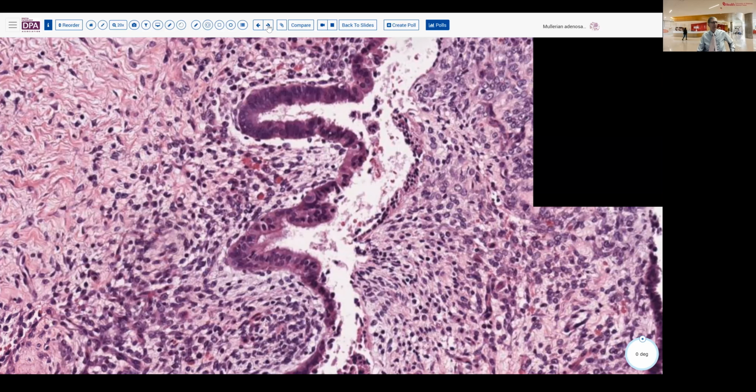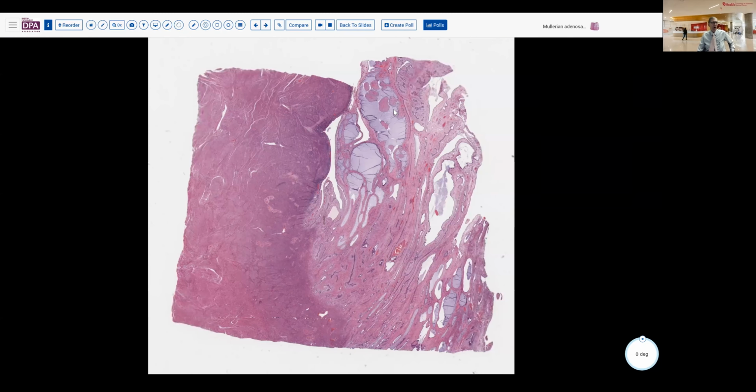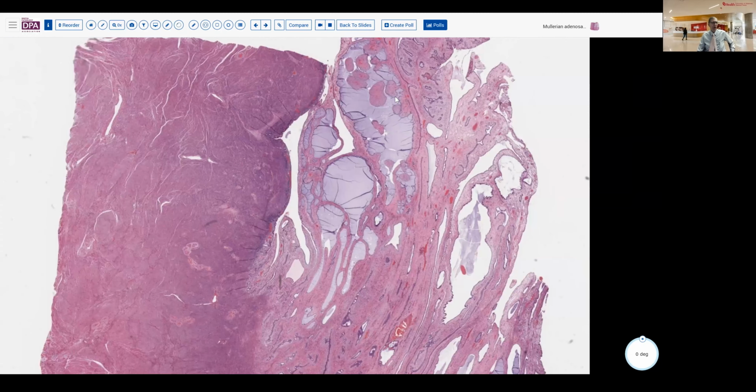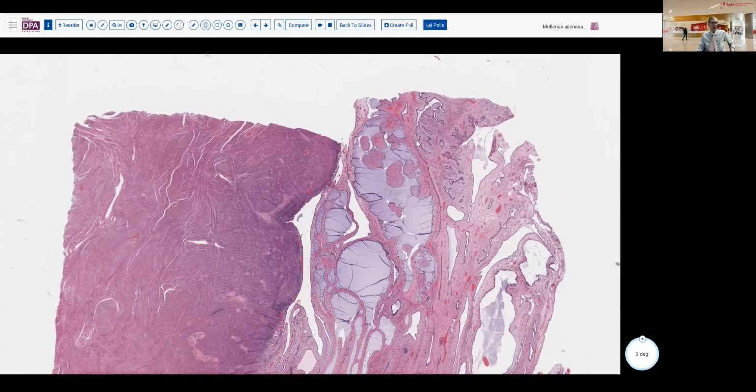On a resection sample, coming on with the next slide, here you'll see how it has a polypoid appearance. Sometimes you can get broad leaf-like growth, sort of phyllodes-like, either within a cyst or more exophytic on the surface, as some of these areas here appear to show that phyllodes pattern of leaf-like growth.